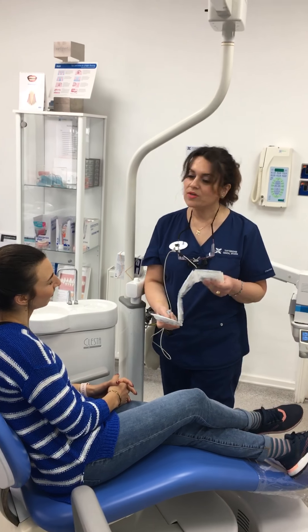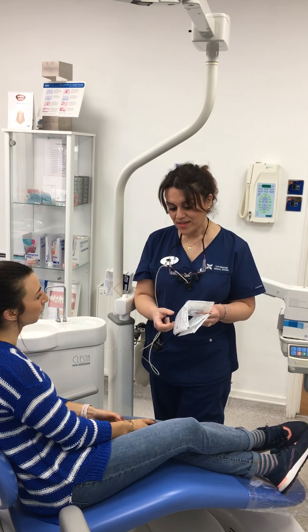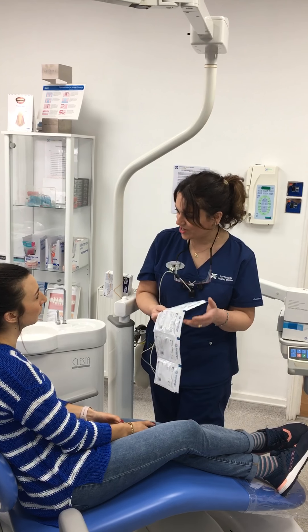So you're going to have 14 weeks of aligners, and you're going to change them one every week. So you're going to start midday now — it's 12:30 — so next week this time, you're going to change again.